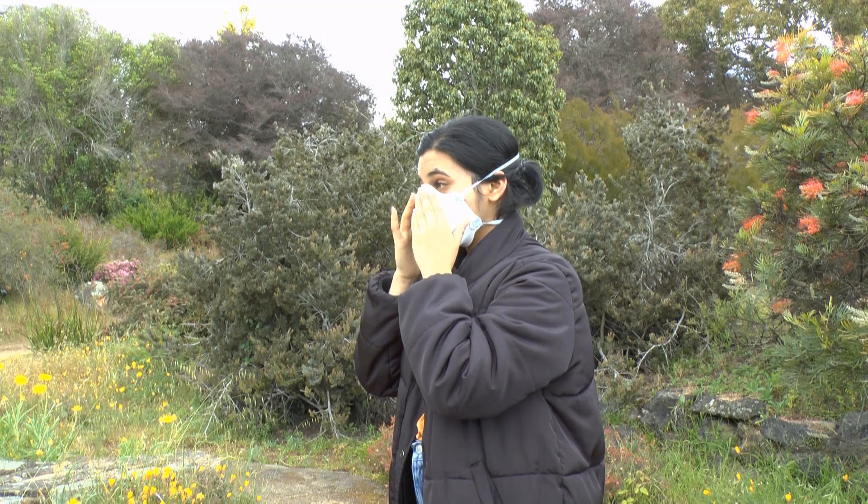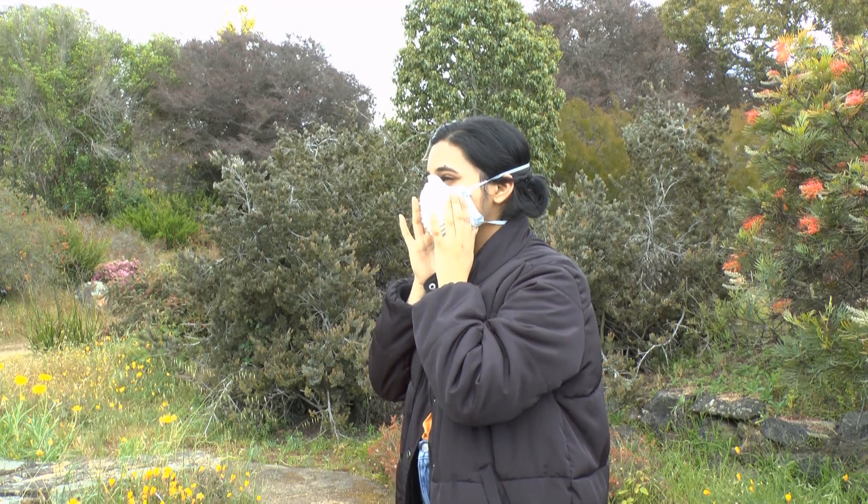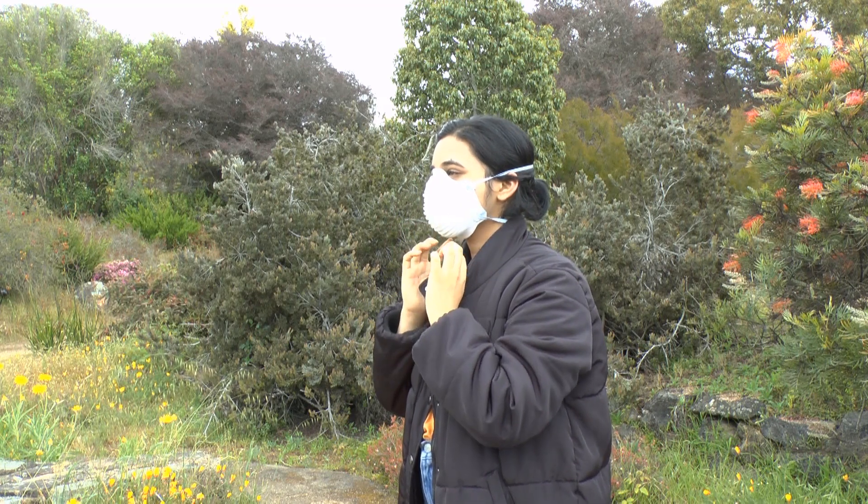Fit the nose piece to your nose and adjust the mask to the shape of your face to get a good seal.